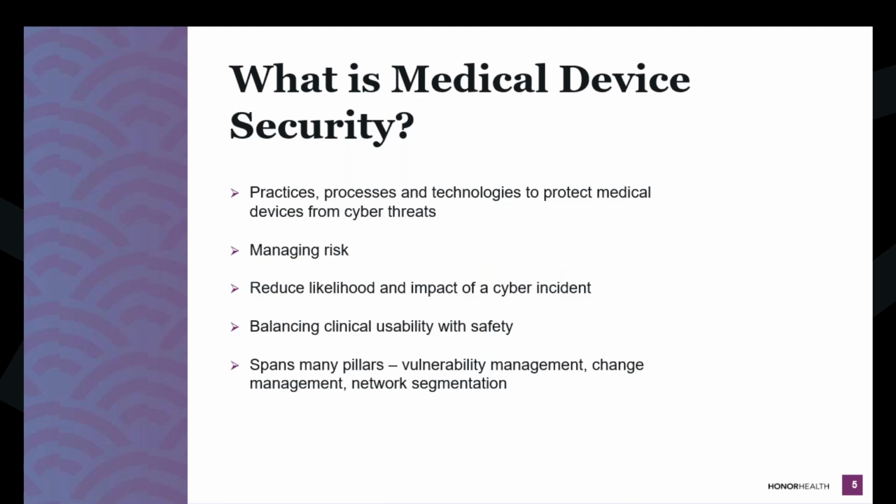Medical device security spans many different pillars. We'll cover those pillars in a minute. One of them is vulnerability management, which we hear about all the time. There's a vulnerability on a medical device, or there's a recall on a medical device, and you need to do something about it. What that something is at the time is most of the time not known, but we'll get there. Change management is a big part of medical device security, and then also network segmentation.